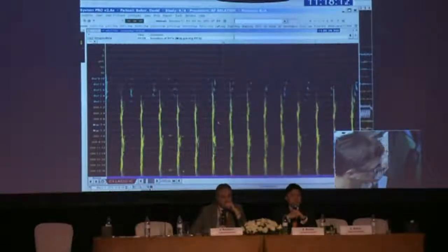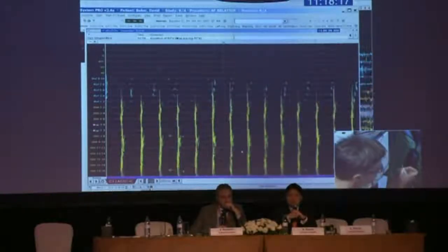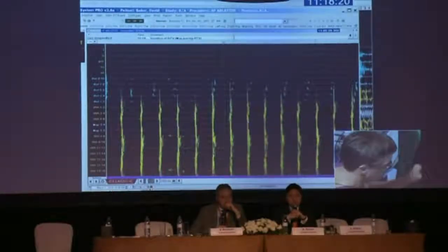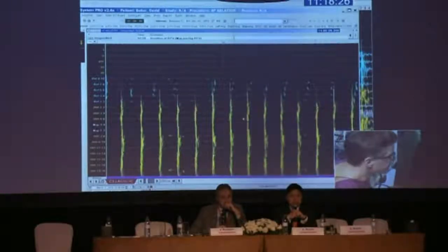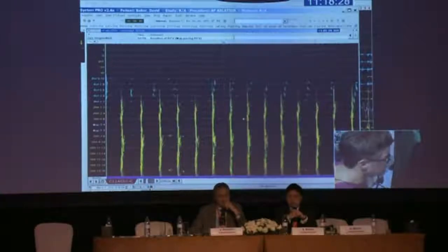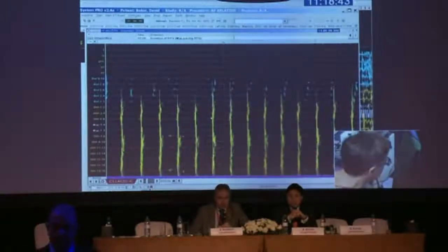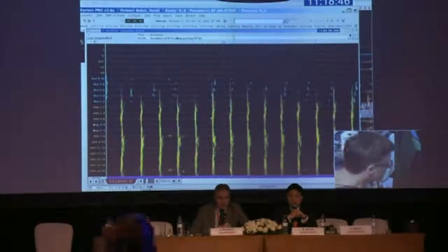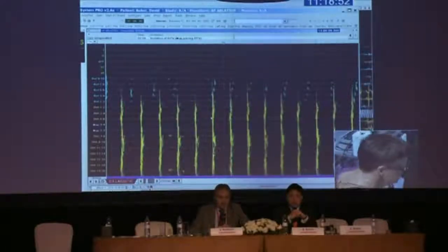So with that starting point, and because I could see patterns, I could then begin to try and find an area or go back earlier than PV 5-6 until I couldn't get any earlier. If it's complete random chaos, you can't do that. If you can't see a pattern, you can't see a generalizable appearance, you can't do that kind of mapping. Then you've just got to start to try and organize it either by giving a drug or by picking off the most chaotic and fast areas in the atria with CFE ablation. So it's not necessarily the speed, it's being able to see a repetitive pattern within that chaos that is the key.